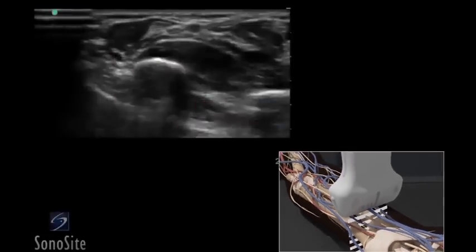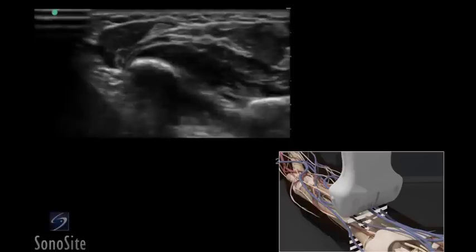The hypoechoic pulsatile ulnar artery is identified. It may be helpful to use color Doppler if the artery is small. The ulnar nerve is an oval or triangular bright hyperechoic structure that lies immediately medial to the artery.